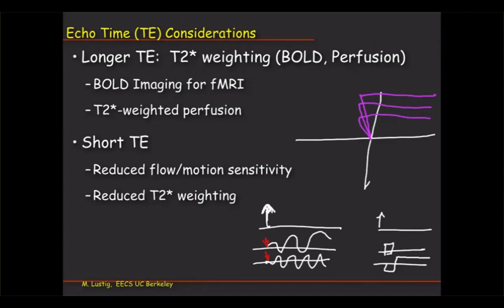The reconstruction, of course, if you want to gain back the resolution that you lost because you didn't actually collect this part of K-space, then you have to perform some reconstruction that compensates for that. And this is one of the algorithms. It's called homodyne reconstruction, but it's beyond this class. Might talk about it. Any questions?